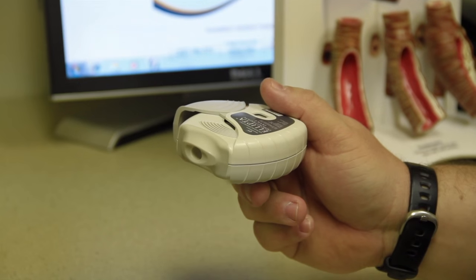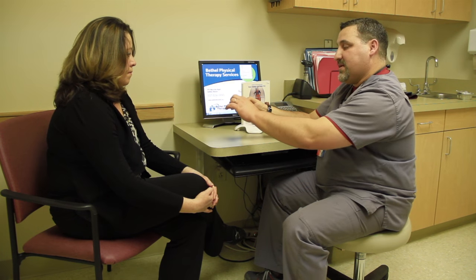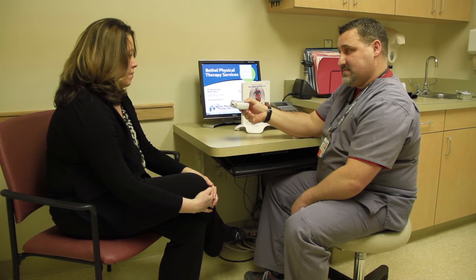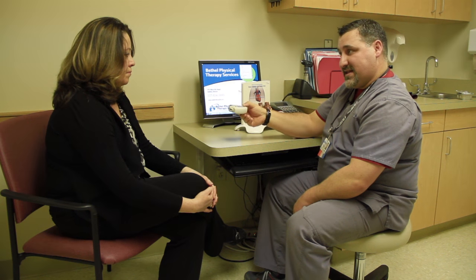The device is now ready to use. I'm going to wrap my lips around the mouthpiece snugly, and take a fast deep breath in as deep as I can. When I have taken a deep breath in, I am going to hold my breath for five to ten seconds.